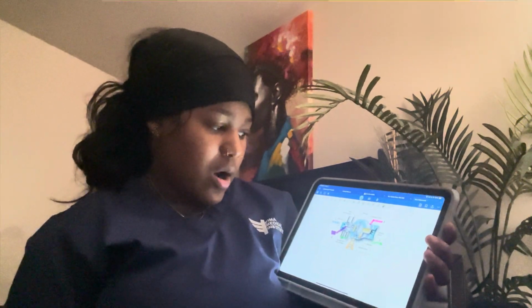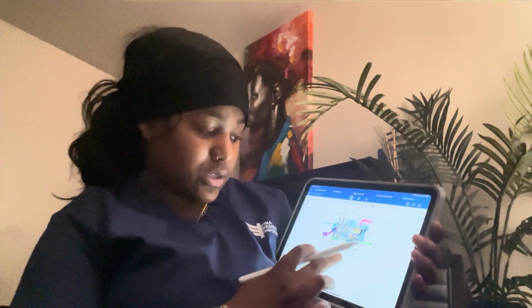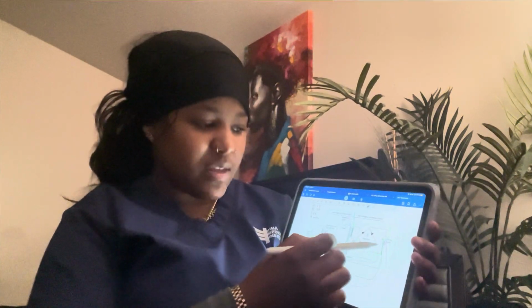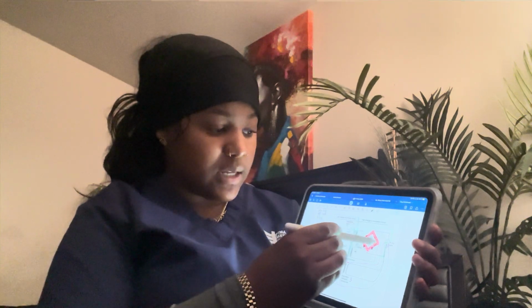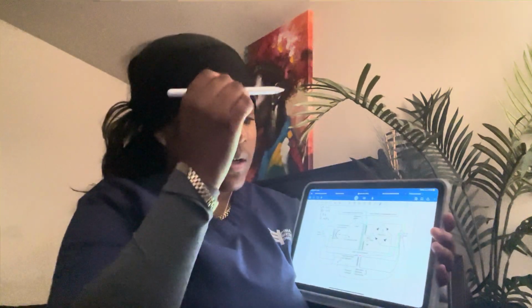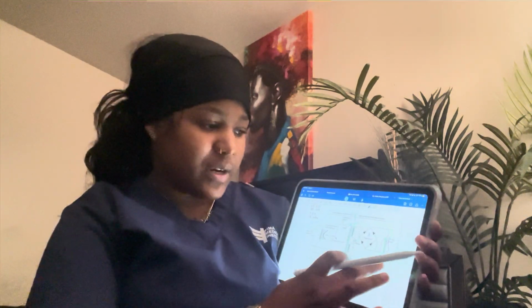And then lastly, we have it to where the X-rays conduct to be able to produce the actual X-ray. I just wanted to touch more base on this area.